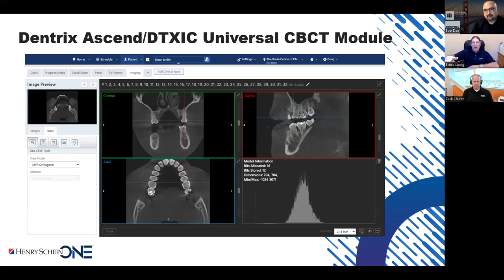And it's Henry Schein behind this that allows many of the hardware manufacturers to open up the kimono, shall we say, and give us the capabilities to speak to the hardware directly so that we can create better integrated solutions. And then they can take their hardware and go up against anybody else's hardware, and it becomes apples to apples instead of apples to oranges. Yes, your hardware is good, but it doesn't work in this way or in this way. Everybody works as best we can, and now it can all be compared on a level playing field.